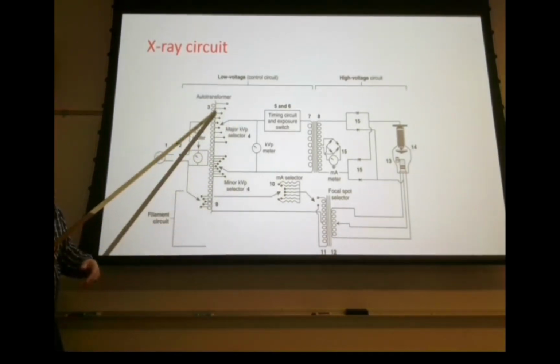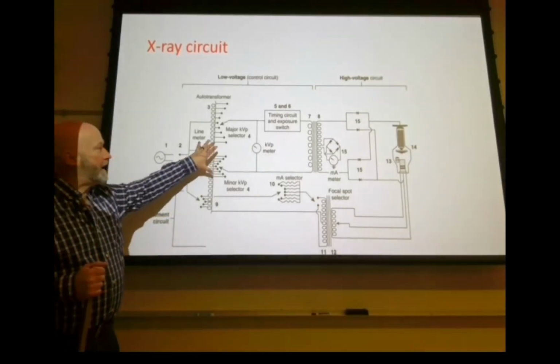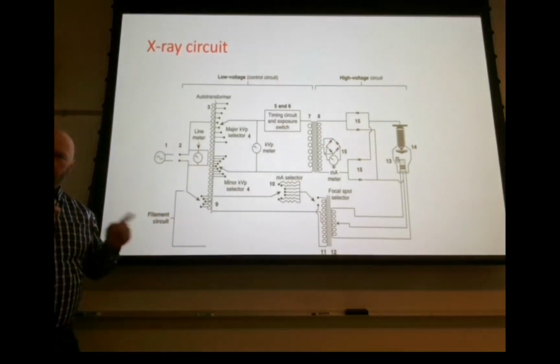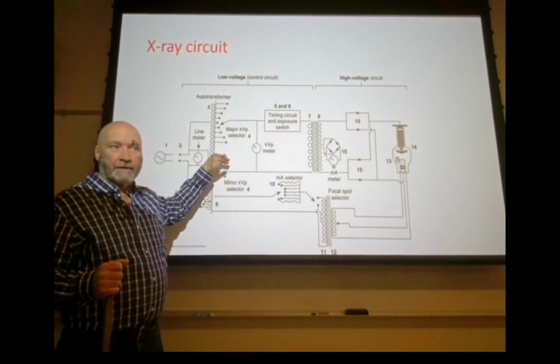That's also a rheostat. You can turn it up, turn it down, okay? So you can increase voltage, you can decrease voltage. Now, again, back to last semester, extremely high voltage is dangerous to work with, okay? And it's hard to work with, it's kind of fickle. So we don't want to deal with very, very high voltage. So if we have our voltage fixed before it gets to the auto transformer, and we make our adjustments, then we have to be able to measure what our voltage is, okay?